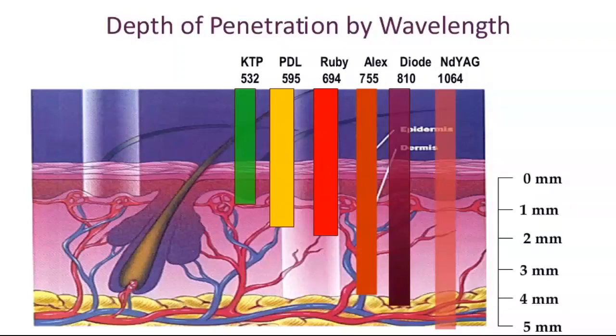with potential epidermal problems. So for the same spot size, if one were to compare the 595 nanometer wavelength with the 532, there's superiority in terms of depth of penetration with the 595 and increased efficacy and safety compared to 532. On the other hand, for very deep vessels where the depth of penetration is of importance, the Nd:YAG at the wavelength of 1064 nanometer will be more appropriate because of that depth of penetration that you get, because it's a longer wavelength.